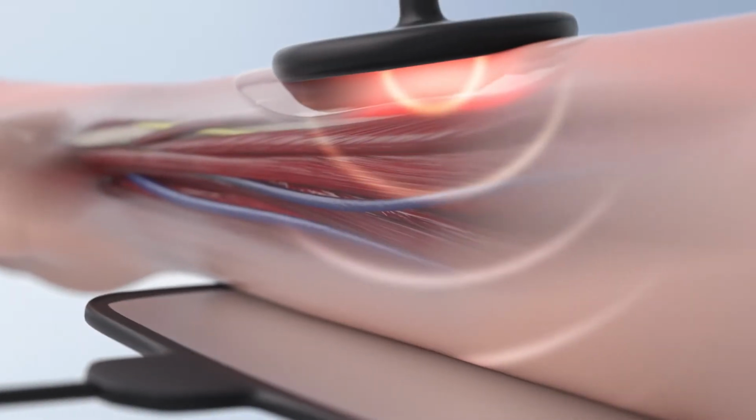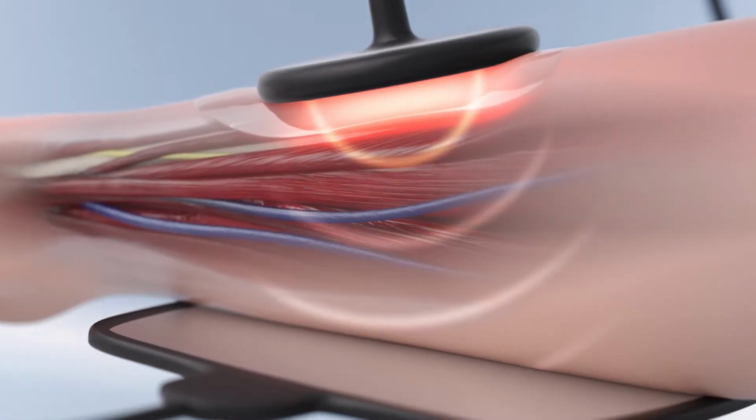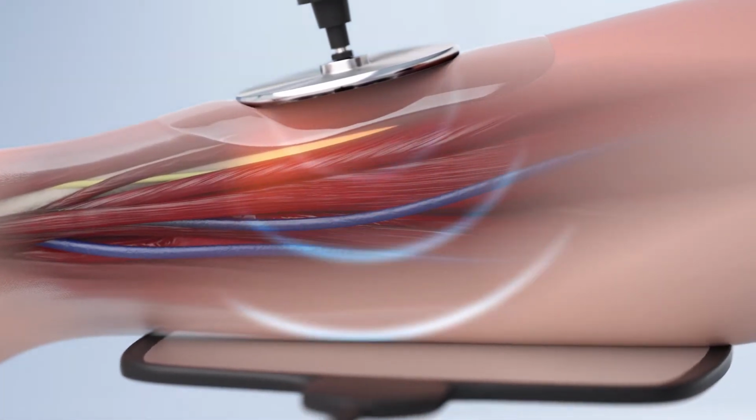This energy is delivered to the body through electrodes that work in a closed circuit using two modes. The first is the capacitive mode, which works on the superficial layers of the skin. And the second is the resistive mode, which has effects deeper and on the most resistive tissues, such as bones, scars, or fibrotic tissues at a deeper level, using high electrical resistance.